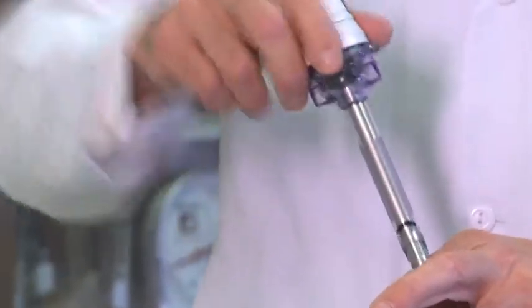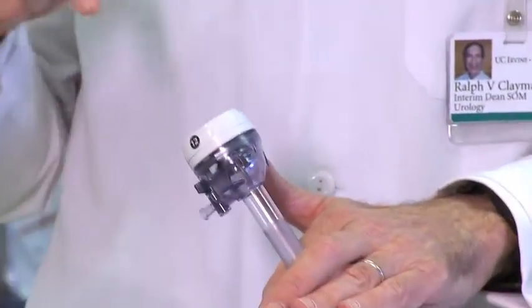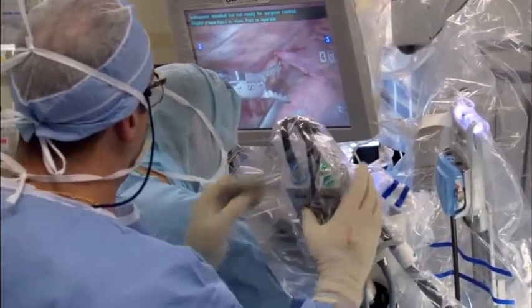So now instead of a big incision to look inside, you could take a trocar like this, which goes right in through the skin. You take this out, and then through here you can put a telescope on a camera. So now you can see everything in the abdomen that you would normally see through that big incision. How do you work? Then you take another trocar and put one over here, one over here, and now you have four trocars: one for the camera, one on the left side and one on the right side for the surgeon's left hand and right hand, and maybe one for an assistant.